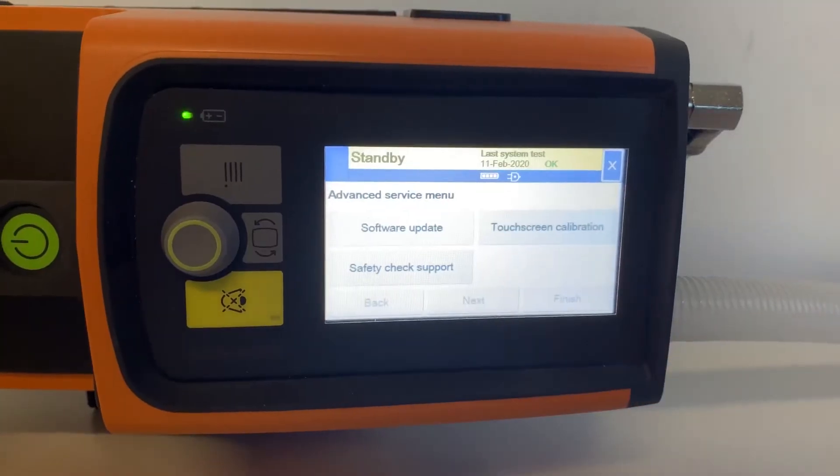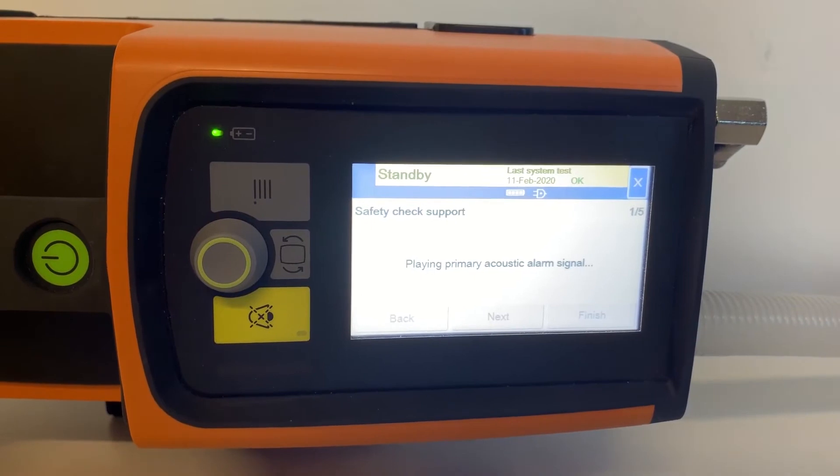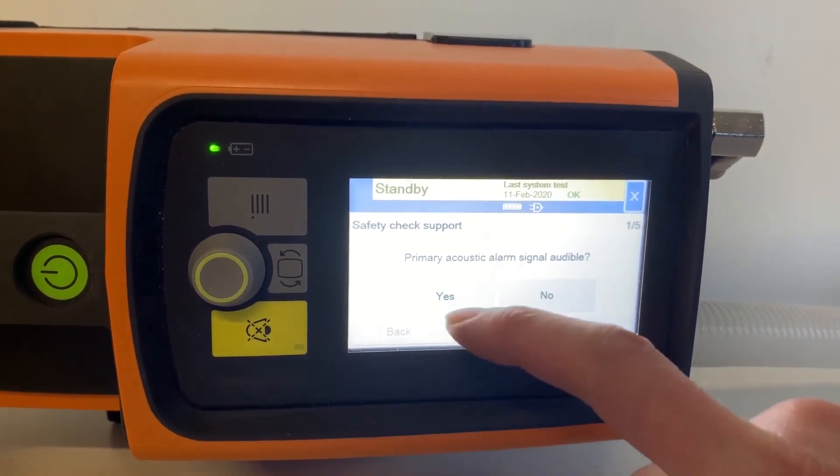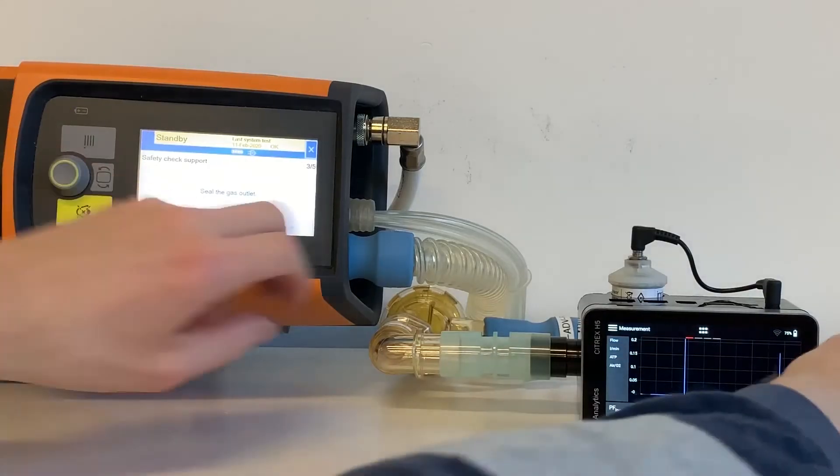Select Advanced Service Menu. Select Safety Check Support and follow the instructions on screen. Is the primary acoustic alarm signal audible? Tap Yes. Is the secondary acoustic alarm signal audible? Tap Yes.